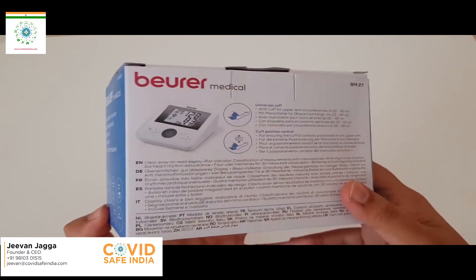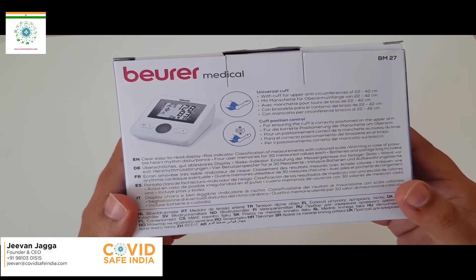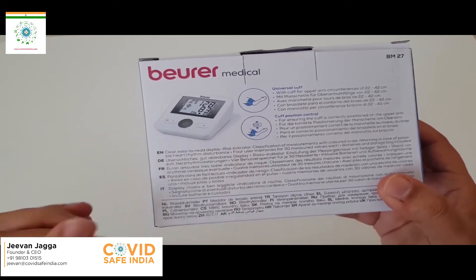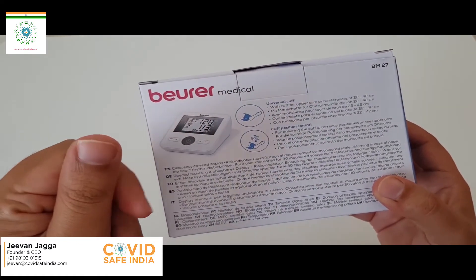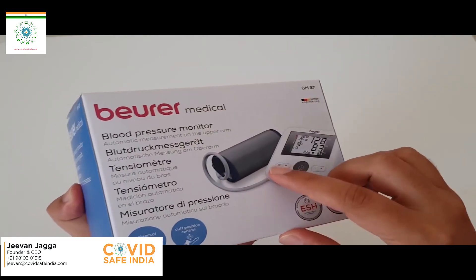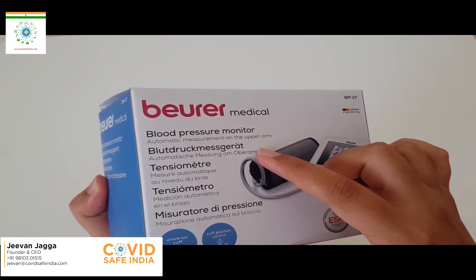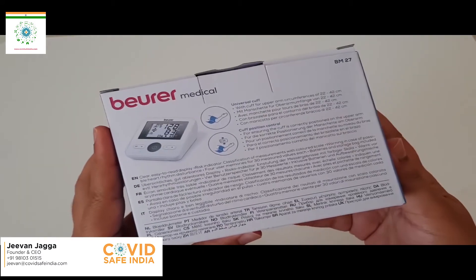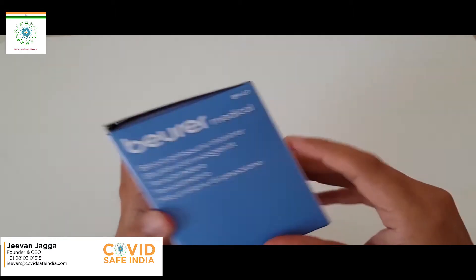This is just an indication showing that it's a medical device. It has a five-year warranty in reality, but the warranty we get here is a standard one year. Here we can see a universal cuff — compared to the previous version which had the cuff directly attached to the device, this one has a separate cuff with an air pipe extension, which should be quite easy to use.